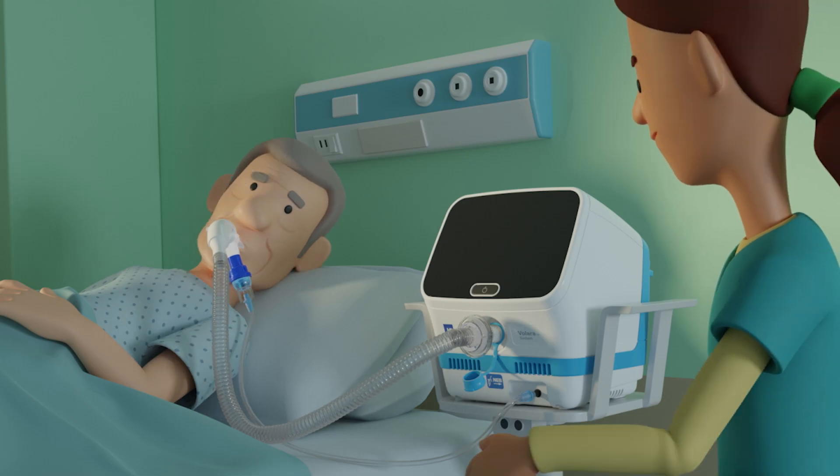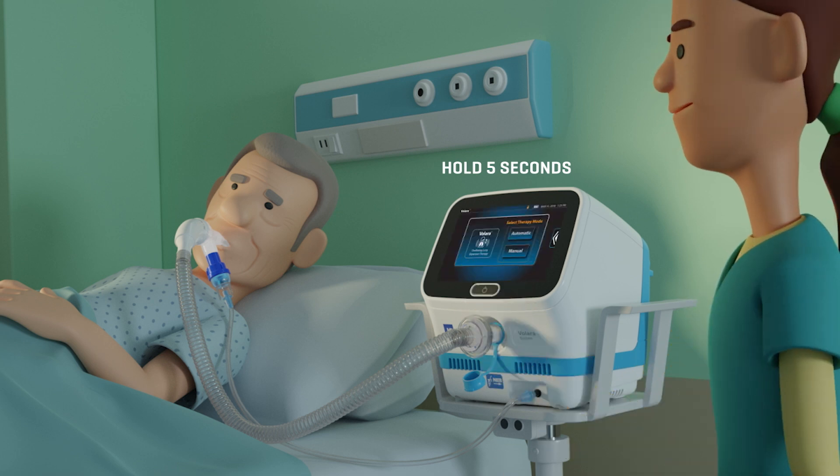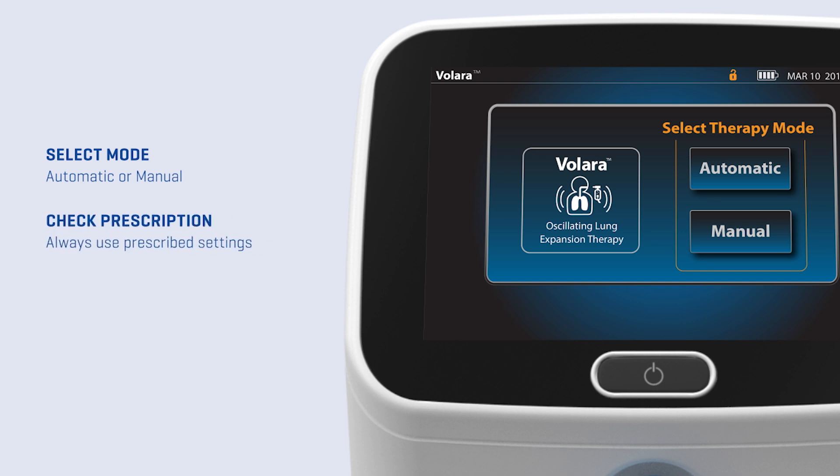To turn on the device, simply press and hold the on-off button for five seconds. When you're ready to begin a therapy, select the preferred therapy mode — automatic or manual. Always use the settings prescribed by the physician.